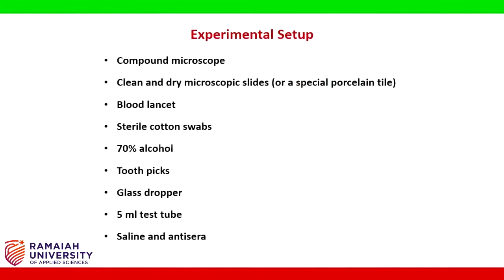Experimental setup: compound microscope, clean and dry microscopic slides, blood lancet, sterile cotton swab, 70% alcohol, toothpicks, glass dropper, saline and antisera.